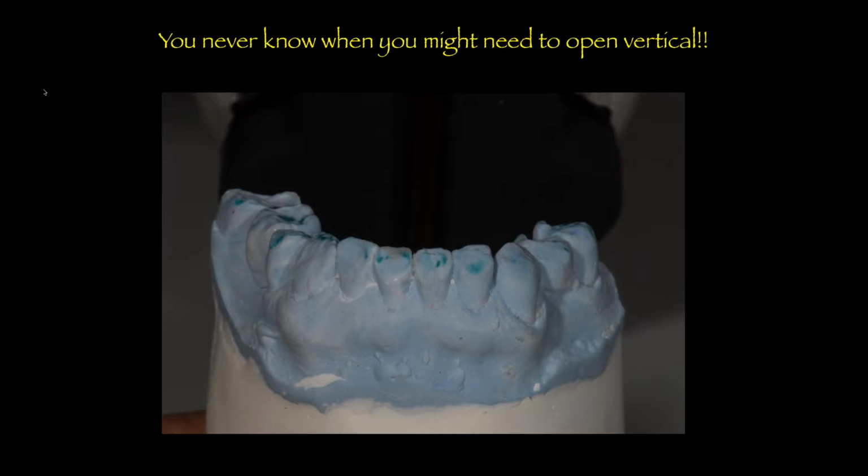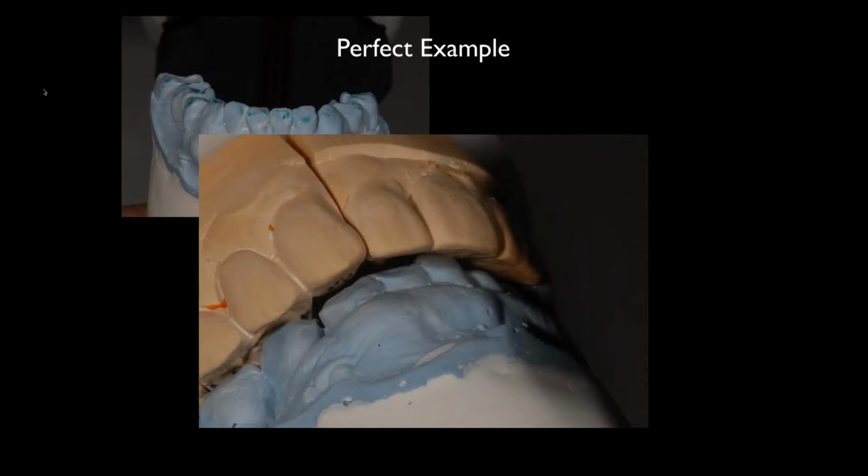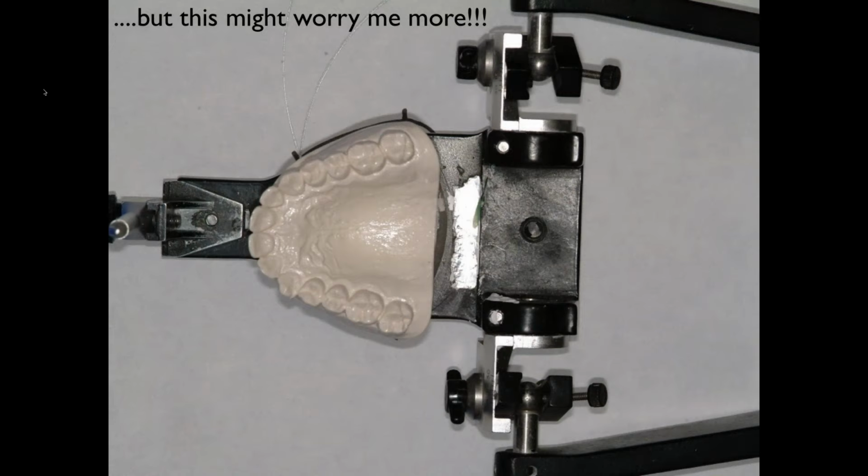Here's a perfect example of lower incisors. We got this case, and you know, we said, hey doc, if we're gonna do this upper, we should take a look at these cases, open this vertical so we can restore these incisors. And you know, believe it or not, he didn't think about that. All right, but again, so here's a case where we're gonna be opening vertical. So if we're not in a reasonably physiologic place, it's never gonna work.